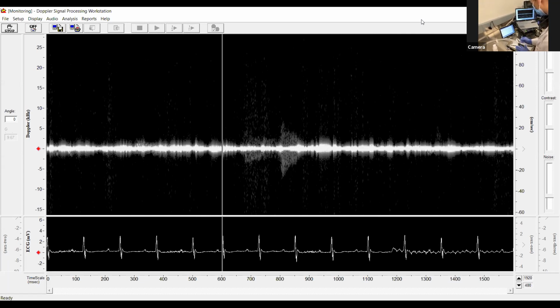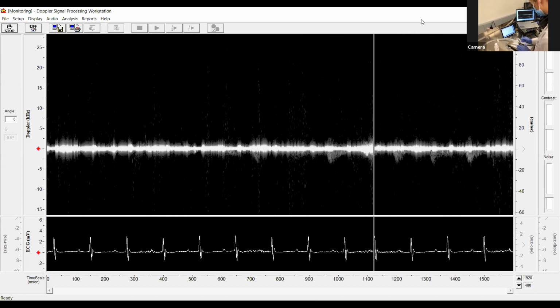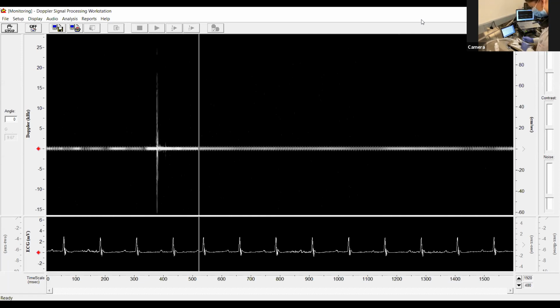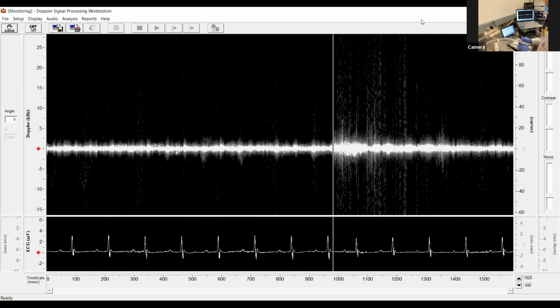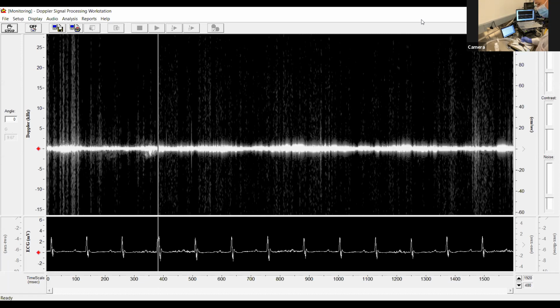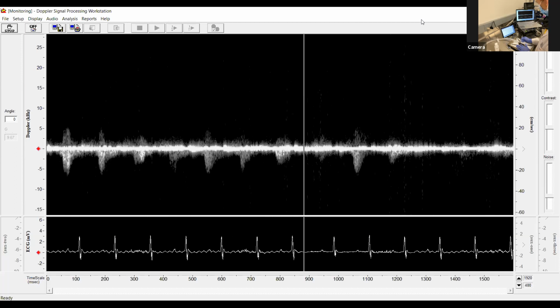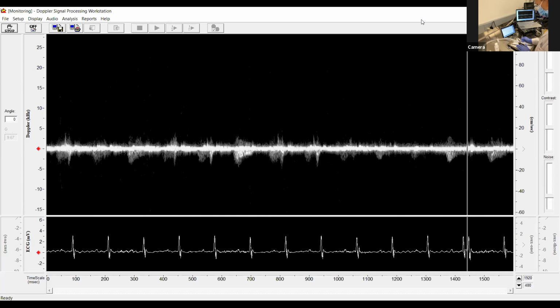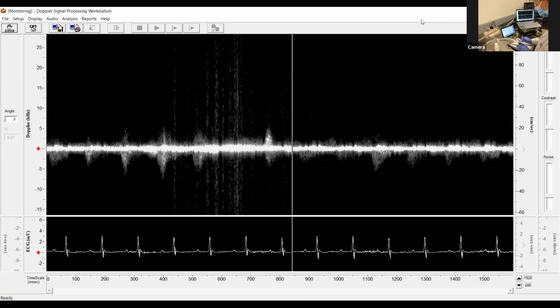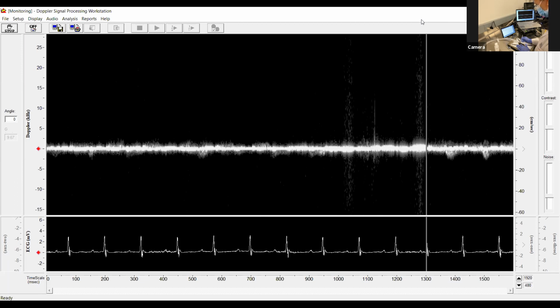You're super close there. I'd say it almost looks like a church. It's got a little building off to the side and then a strong spike up. This can be used to look at coronary flow reserve. This is how much the heart can respond to stress. So how much can those coronary vessels dilate to bring more blood flow to the heart in times of stress?